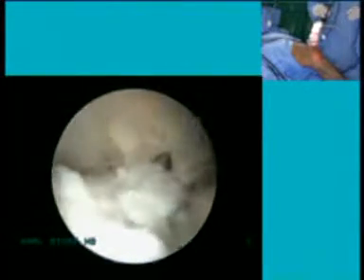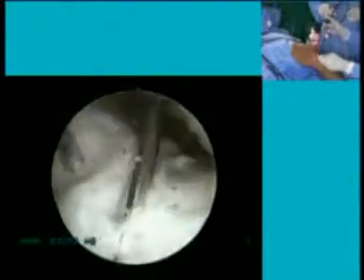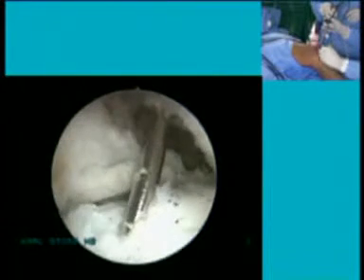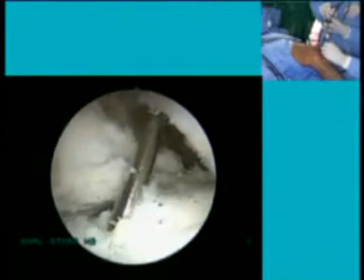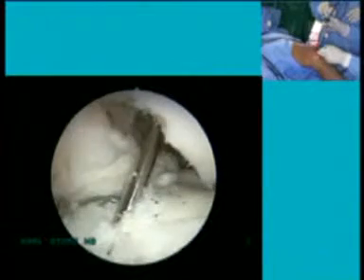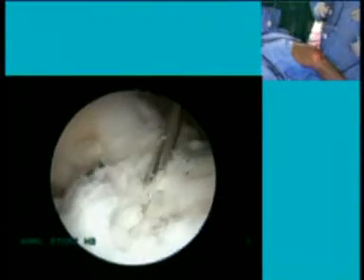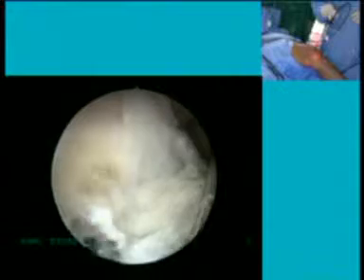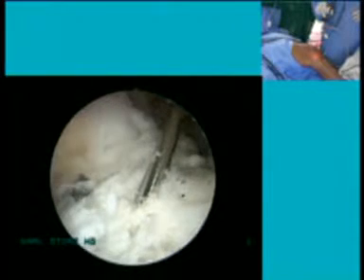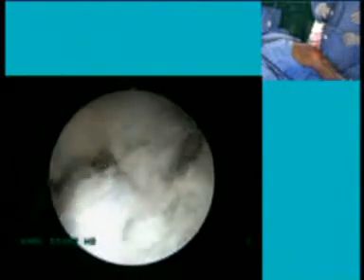What was the footprint length? Did you measure the tibial footprint before proceeding? Normally not. But you know, where we are, these fibers here, this is the root of the lateral meniscus. And the root insertion of the lateral meniscus is very close to the PL tunnel. Therefore, I think we are in the right position with our PL tunnel. But of course, we will have a confluence in this case. So confluence of tunnels on the tibial end is perhaps not as much of a consequence as in the femoral end. You're happy with the confluence on the tibia? Yes.